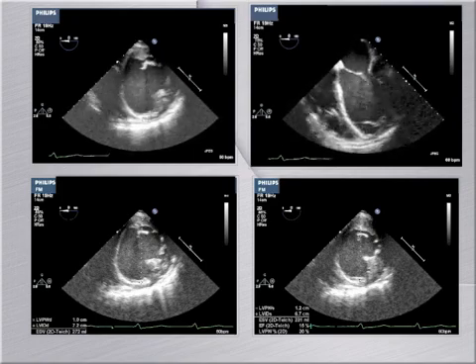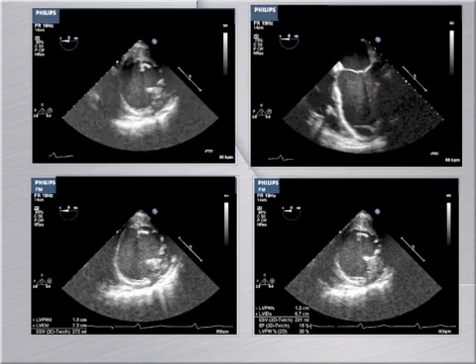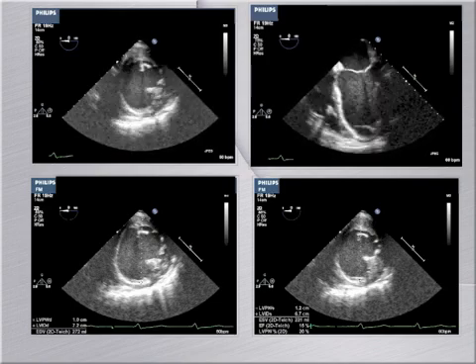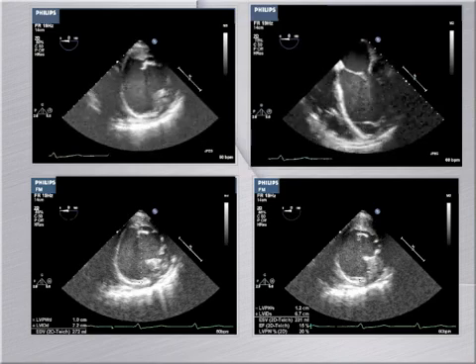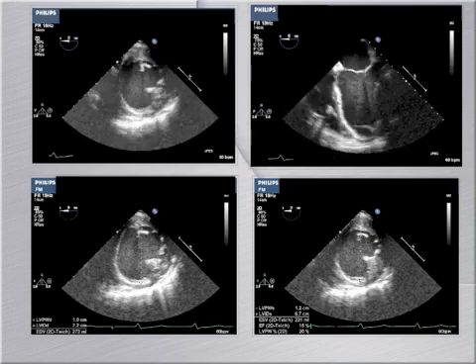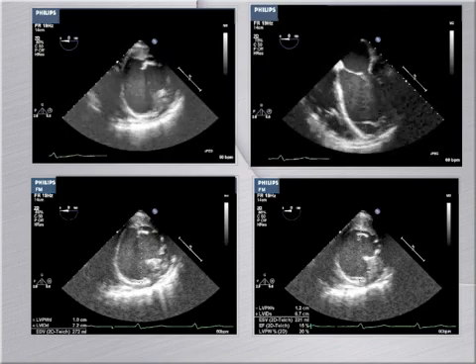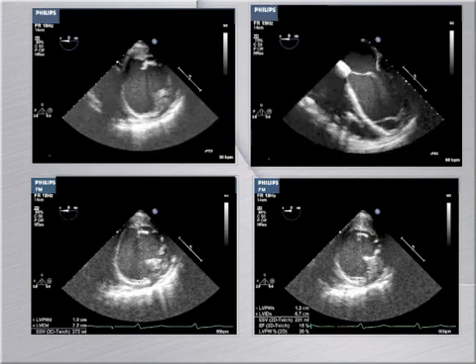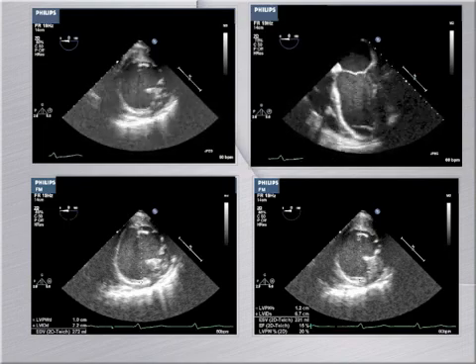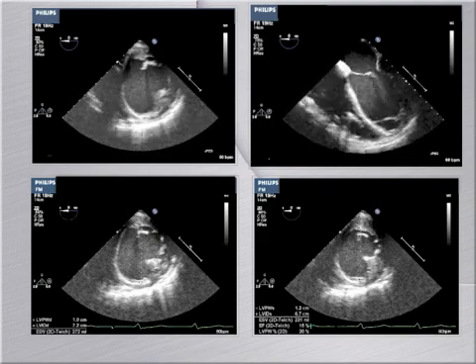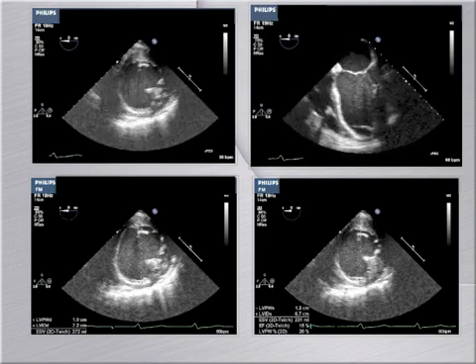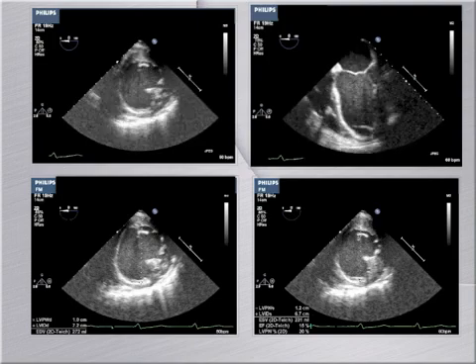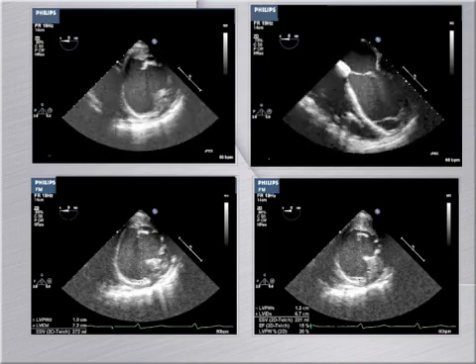This heart appears globally dilated and hypocontractile, both in the transgastric image and the four chamber image. Ejection fraction is around 15%. The end diastolic diameter measures 7.2 cm, which is severely enlarged. The end diastolic diameter in another view measures 6.7 cm, with a calculated end diastolic volume of 231 cc and a calculated ejection fraction of 16%, all suggestive of severe LV dysfunction.